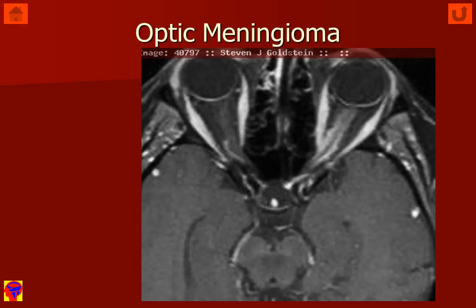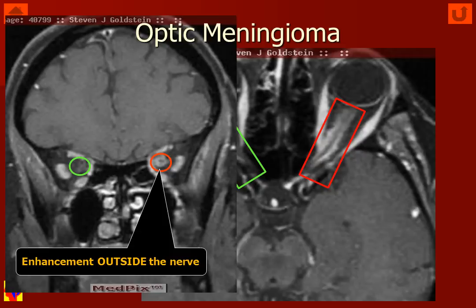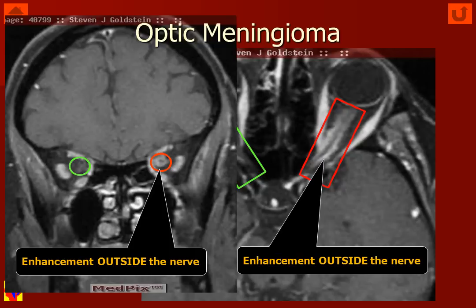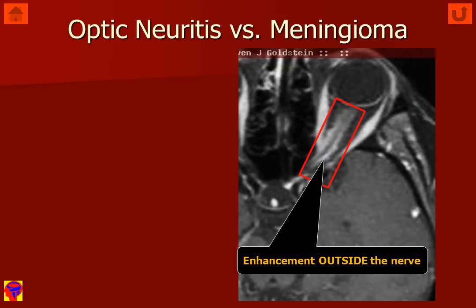In another case of optic nerve sheath meningioma, the green rectangle demonstrates the normal lack of enhancement of the optic nerve in the patient's right orbit. However, in the left orbit inside the red rectangle, we see peripheral, somewhat nodular enhancement around the outside of the non-enhancing optic nerve in the center. In the coronal image, we can see a ring of enhancement surrounding a non-enhancing optic nerve. Terms used to describe this appearance include a target sign or bullseye sign for the coronal pattern, and a tram-track or railroad-track sign for the axial images in optic nerve sheath meningioma.